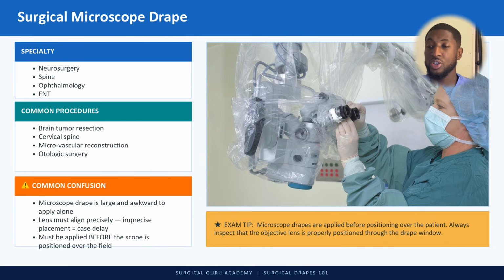I worked somewhere in North Jersey where we needed to put this drape on the microscope, and the drape we actually had wasn't the right size for the microscope. So we had to kind of makeshift it. There were two sets of eye holes, one for the doctor and one for the assistant, but there weren't enough holes. So it was an interesting experience, but it definitely takes some practice to get this down.